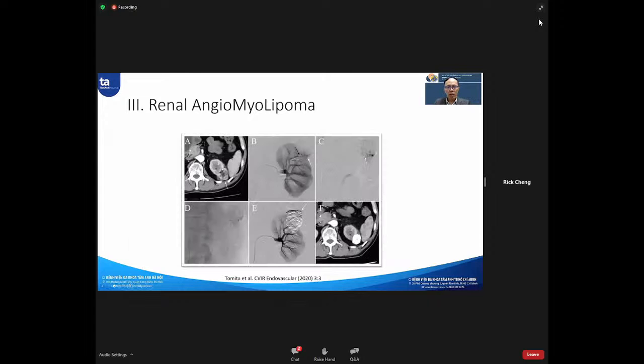And in another case, we do the embolization of AML with Lipiodol. You see the AML on the left side. You do the global angiogram and see the hypervascularity, and after you insert the microcatheter distally to see the whole AML hypervascularity here, and you inject the Lipiodol with the particles.